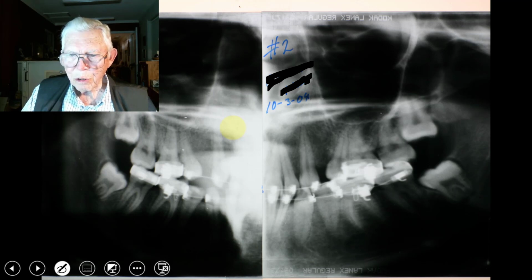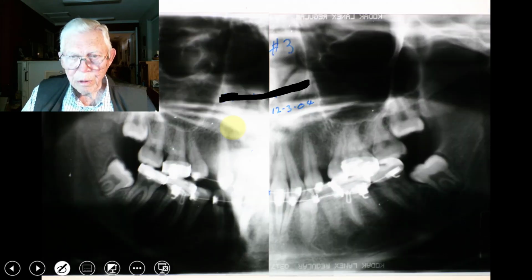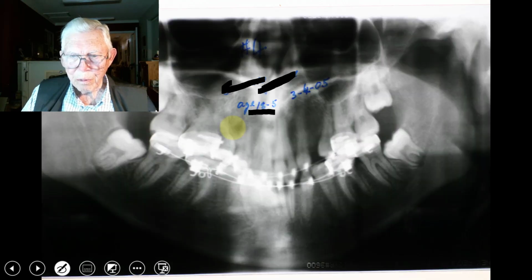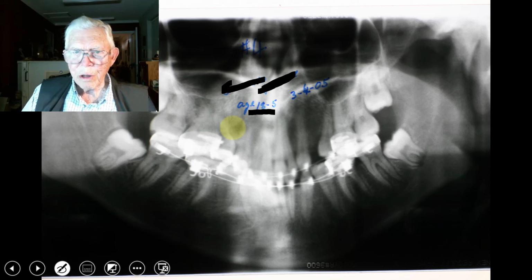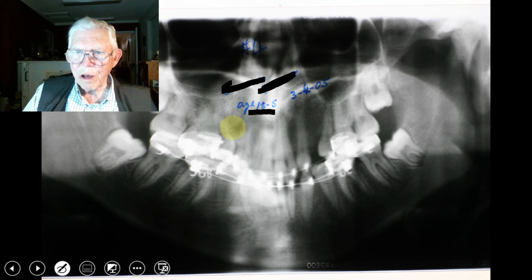And so we took the teeth out on her and started the work. And this is the second Panorex. And here, let me go back one. That's the third one. And the spaces are still there. We haven't closed that. And here, at this one, we've got our age is 18 and 5, and it's '05. And so she's probably 16 or 17 there when we started this.